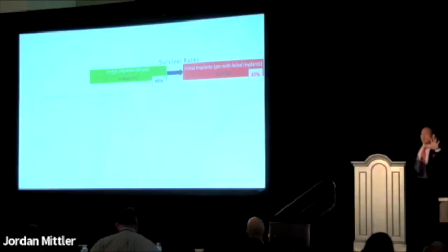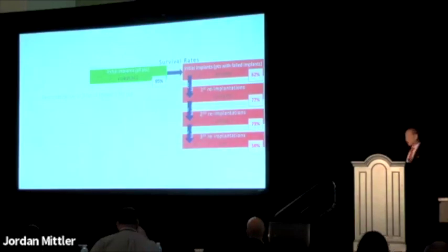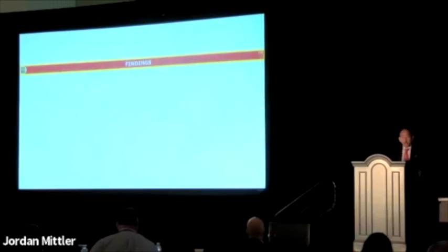Of that 5%, we went and placed an implant into that site again. What we found was that the success rate was a lot lower in that group of patients. In that particular site, it was 62%, 77%, and then we kept on trying in the ones that wanted to try, 73%, and then of course 50%. So replacing implants in that site was not as successful. So there's evidence for two types of failure: the cluster failure that I told you about with patients, and the site failure, the site factors. If you go back to that same site, it failed.